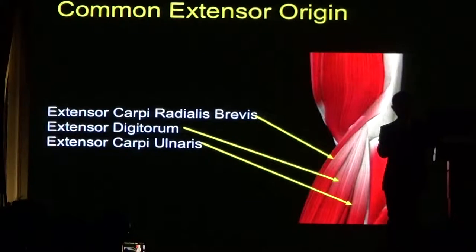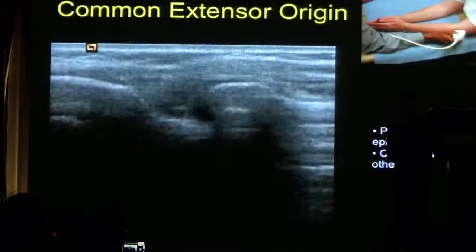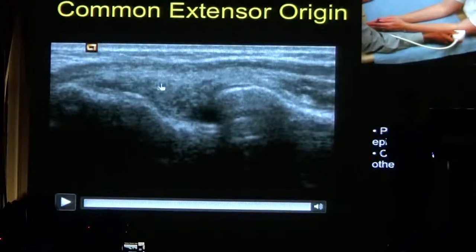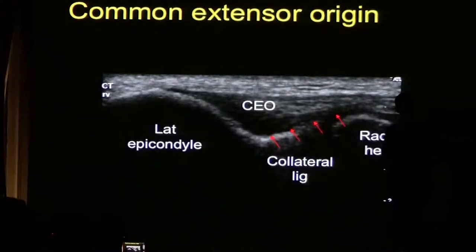The common extensor origin is very important because many patients suffer from tennis elbow. This is the longitudinal view of the common extensor tendon. We can see it attaches to the lateral epicondyle and should have a nice fibrillar structure. You can also identify a structure with fibres traveling in a different direction — that represents the lateral ulnar collateral ligament, which lies deep to the common extensor origin.